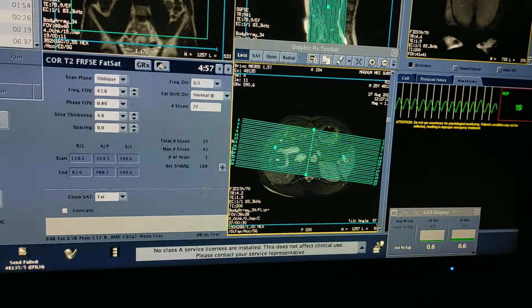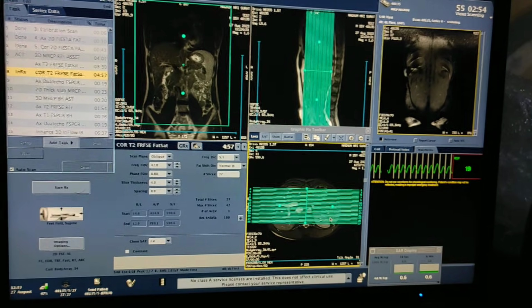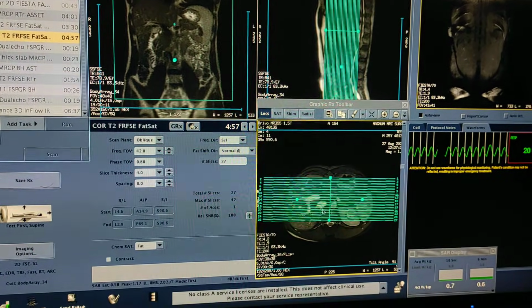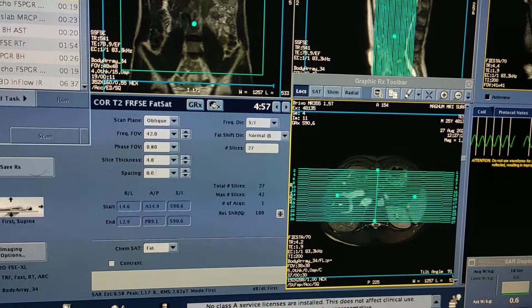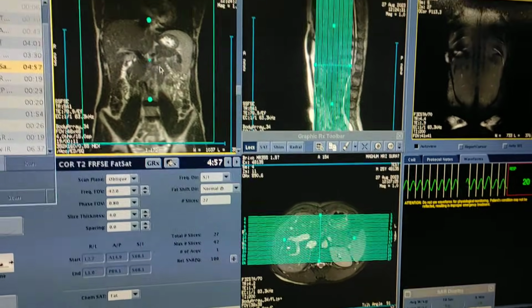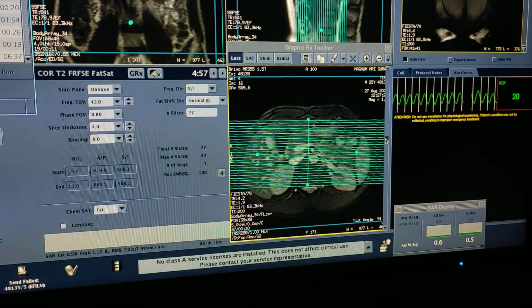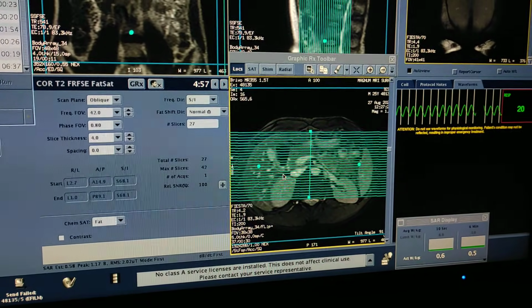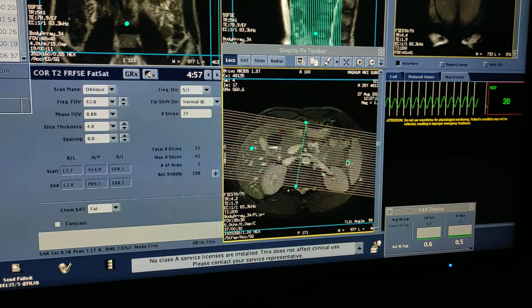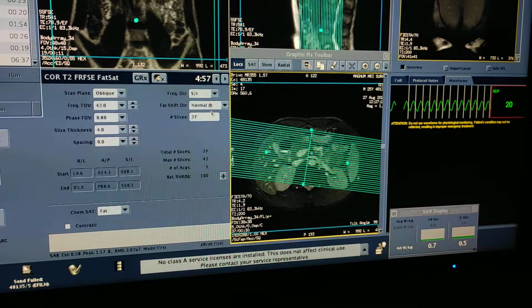Always take minimum slice thickness, because sometimes there is a small tiny calculus in the CBD, sometimes in a cystic duct or sometimes in a pancreatic duct. So to diagnose the tiny lesions, you have to take a minimum slice thickness with 0 spacing. Okay, so this is very simple. Again, you have to first of all set the FOV on the coronals. Now you have to plan on the axials. Same, you have to cover gallbladder, pancreas and CBD. Again for the coronal, same angulation, you have to do parallel to tail of the pancreas.